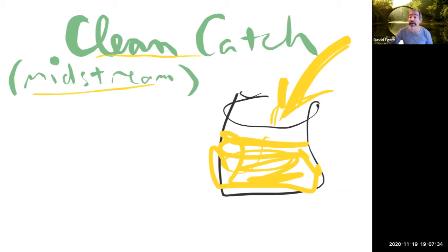When we do our lab next week, where we actually care about the total volume of urine, then obviously it's not a clean catch. There you have to catch every last drop if you want to know the total volume you peed out. But if you're just interested in the qualities of your urine, what's dissolved in there, you just need a nice little sample.